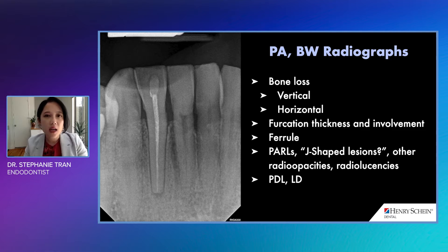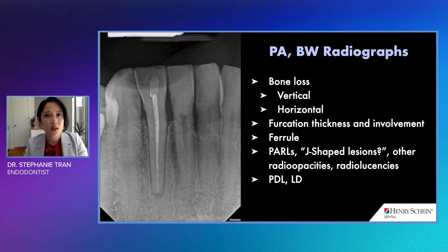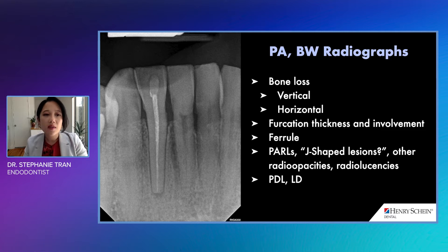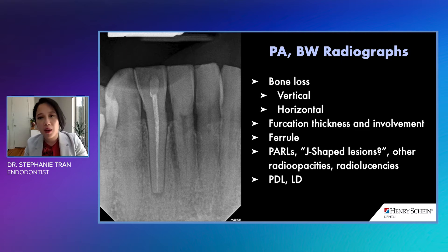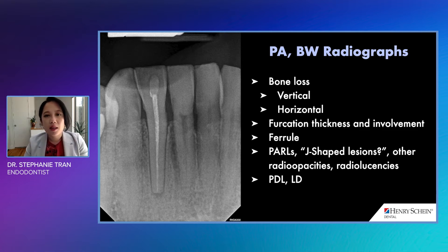We want to take a look at the furcations of teeth that have multiple roots as well as what kind of restorative issues there may be going on with the tooth, such as if there's caries, bone loss, tooth structure loss, ferrule issues, and if there are any lesions associated with the tooth — especially J-shaped lesions, radiopacities, and radiolucencies — and then if there are any PDL or lamina dura issues surrounding the tooth that may be associated with a radiolucency.